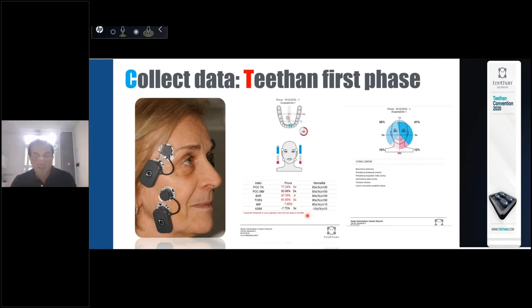So when I extract some teeth, I want that when I produce this new exam, the patient can bite cotton rolls very well. You can see on the screen a red signal. If you have a red signal, you have a problem in the exam, so the measures are not good for this patient. Or you can see a green traffic light, or yellow, depending. The best is green.